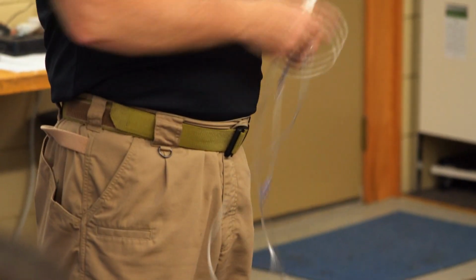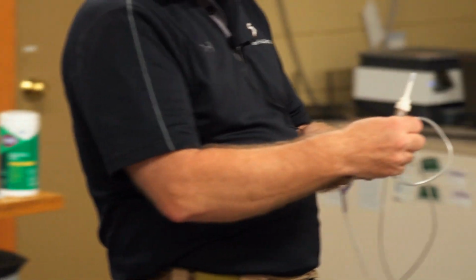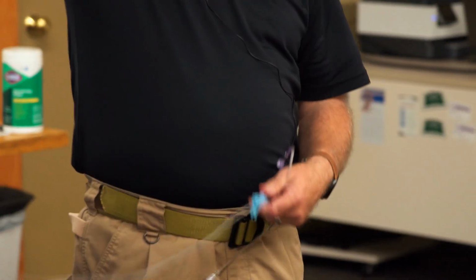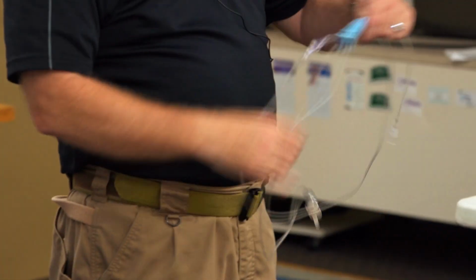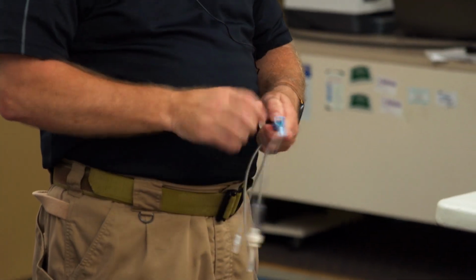Okay. In my Combat Lifesaver class, they taught us to put it down here, because if I started it on you, my combat casualty, and I had to leave you, you could then control your own rate. So it was closer to the patient. That was why it was down there. But you may have a bag hanging up here, but you want to talk to your patient and see what's happening. You may want it down there. It's totally up to you, however you want to do it. Okay. I generally put it up here, but that's just me.